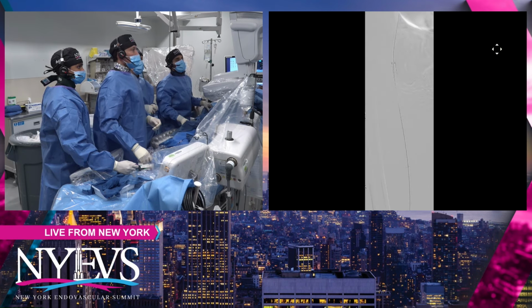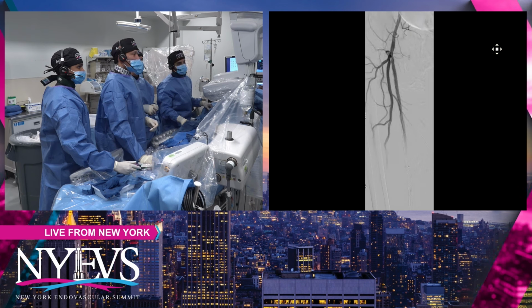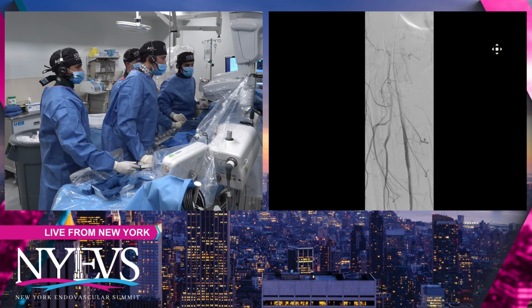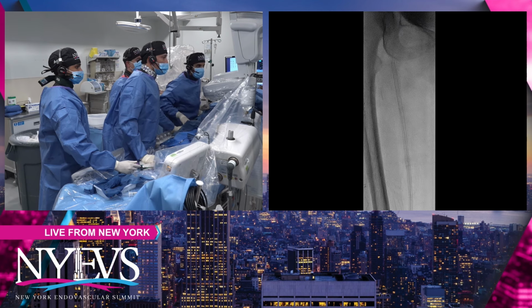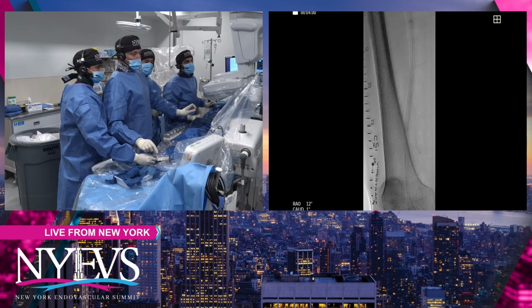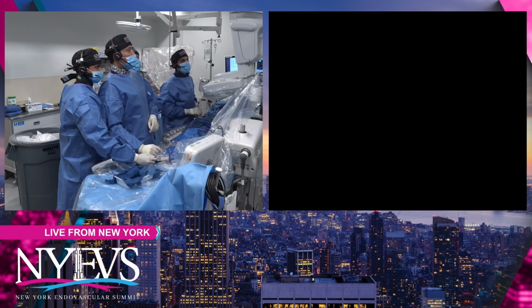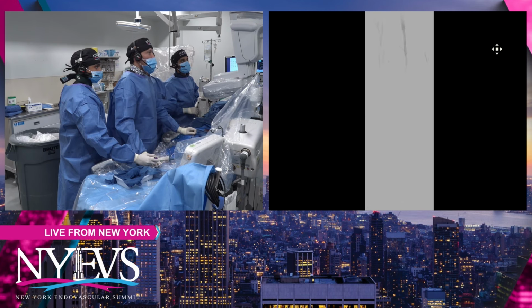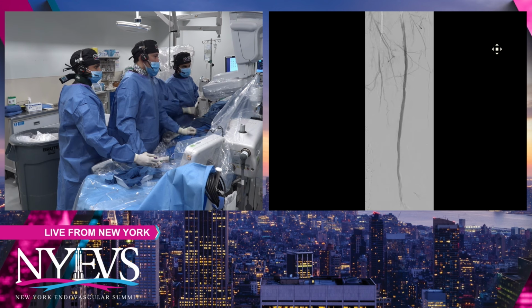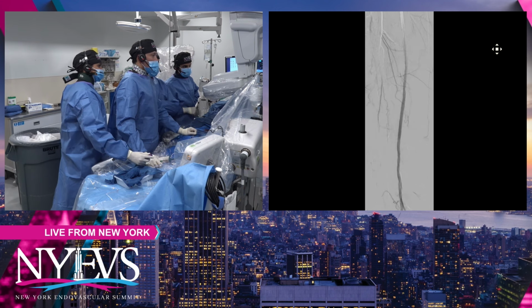Did anything surprise you on the IVUS? It actually looked not too bad. Very good. Go for it, John. And that's the proximal, looks good. The distally, again, you can see it's much better flow. I think the distal segment looks very good after the DCB.